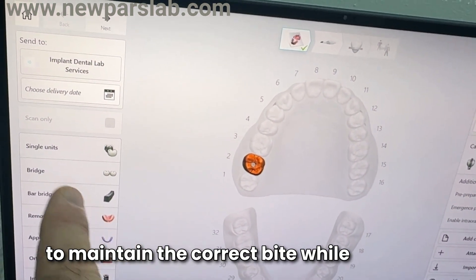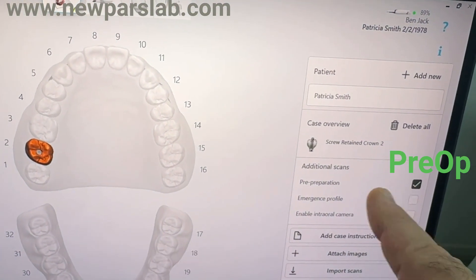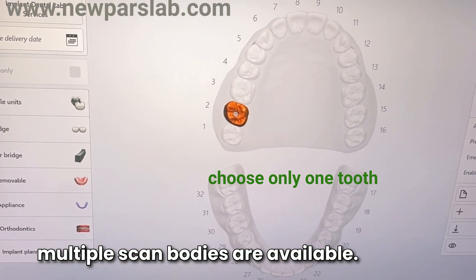In this video, I demonstrate how to maintain the correct bite while scanning for an all-on-X case using the TRIO intraoral scanner. Initially, we select a single crown screw retained scan body, even when multiple scan bodies are available.